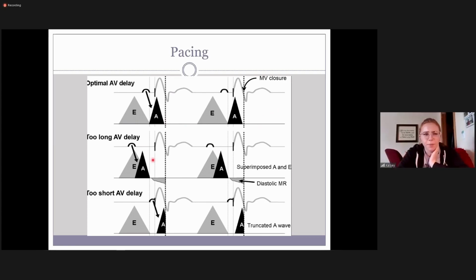So Scott, can you show me where the AV interval point measurements are supposed to be?